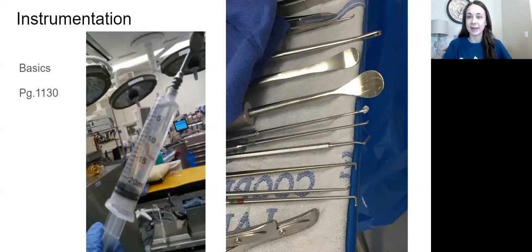So malleable retractor can, yes, be placed on the brain because all the blades that go with those self-retaining retractors, the Leyla and the Greenberg, they're the same. They're little malleable ribbons. They're just attached to a device to give more traction and to pull on it. So everybody's way of thinking is a little bit different on this one. The surgeon I worked with did multiple studies that showed that there's brain damage happening when retractors are pushed on the brain tissue too much. Other surgeons found different ways to pad the brain, which I'll go over, but some surgeons have just found different techniques and have taken the retractors out altogether, like the one I worked with. So lots of different options there.